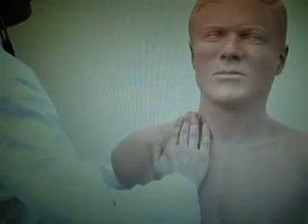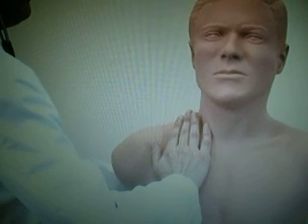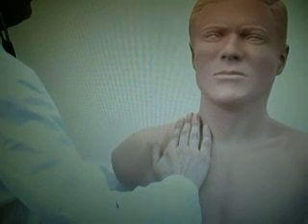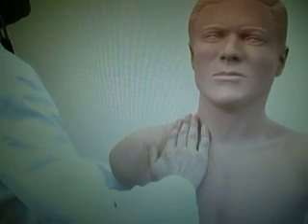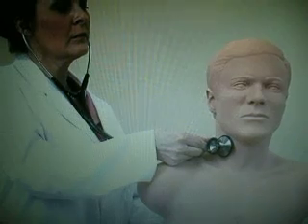Severe aortic stenosis can be felt in the neck as well. To determine if the murmur is a grade 4 or above, place this part of the hand on the upper chest. You'll feel a systolic thrill. The direction of the thrill is toward the right neck. Listen with your stethoscope, and this is what you will hear.